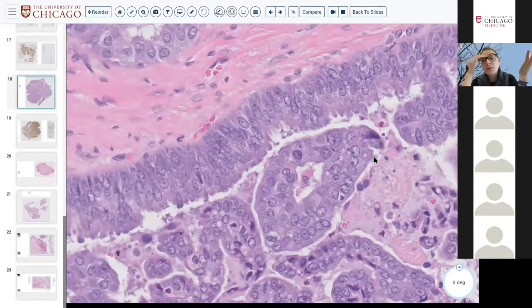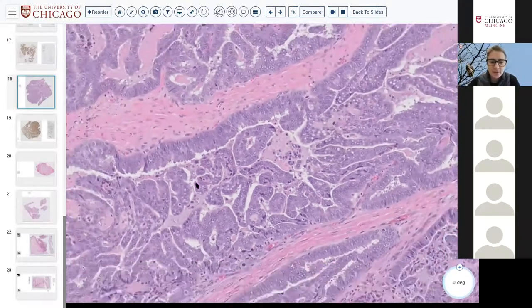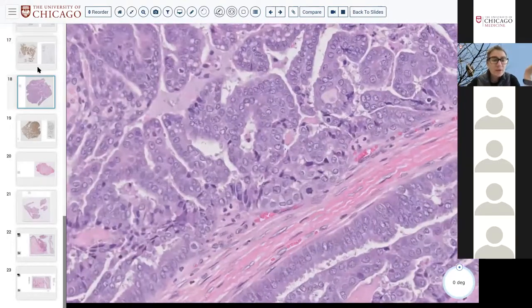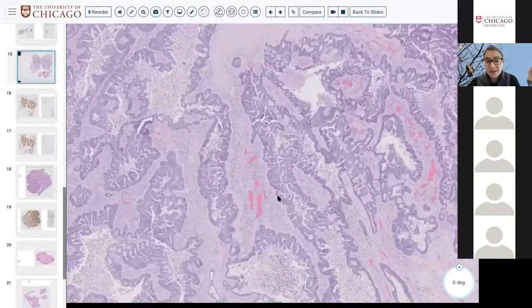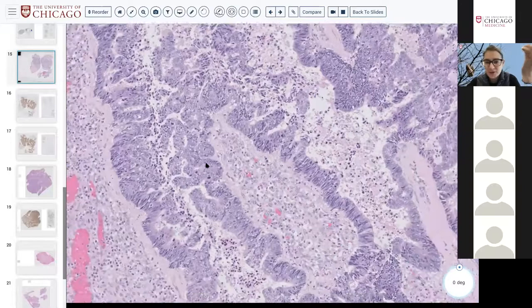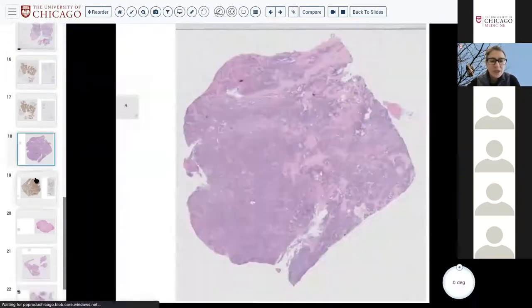We don't really grade for squamous because we don't find that histologic grade is useful. But for adenocarcinomas, we do grade. And so we would always want to estimate a grade for our adenocarcinomas. And I would argue that by default, the intestinal type are essentially considered high grade, and that manifests in the amount of grungy necrotic material, the high amount of mitoses, the high amount of pleomorphism.